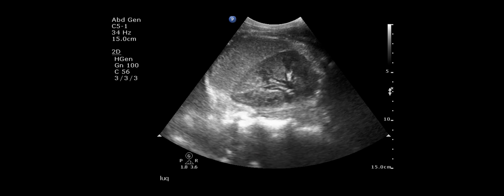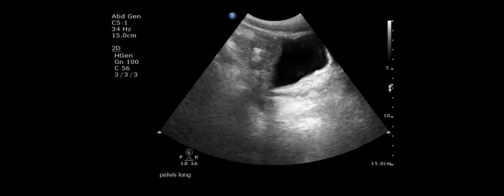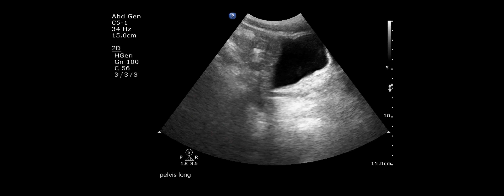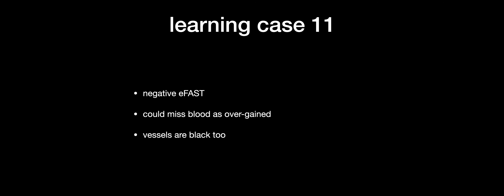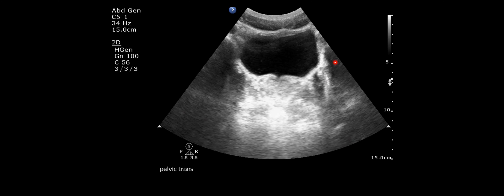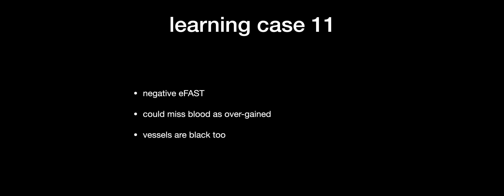Case eleven is a 30-year-old motorcyclist versus kangaroo. The image is a little over-gained. You can actually see a ureteric jet draining into the bladder. The over-gained image is problematic because subtle amounts of free fluid sitting within this area could be hidden. We need to improve overall gain and notably the TGC so we can better assess whether findings are pathological or incidental. Remember blood vessels are black too — you'll commonly see iliacs in this region, and as you move inferiorly they become more superficial. Don't confuse iliac vessels for pathological processes.